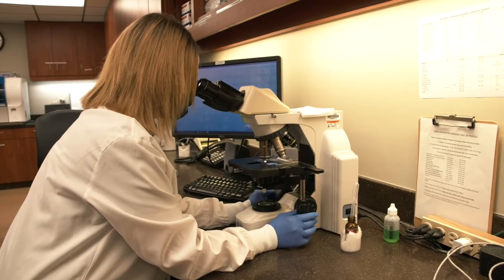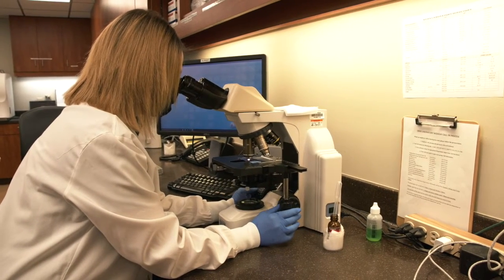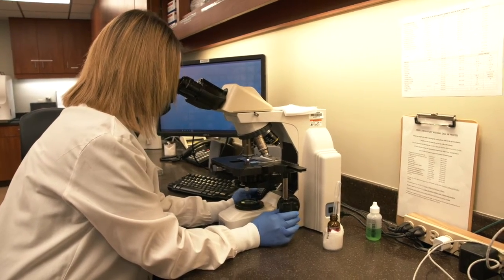They report this in the report to the ordering provider, and it'll help as a diagnostic tool when they're monitoring patients. Unfortunately, sometimes in the lab, we are the first ones to see those abnormal leukemias and things like that, which are then taken to the pathologist for review when we find these abnormal cells in the patient's blood.